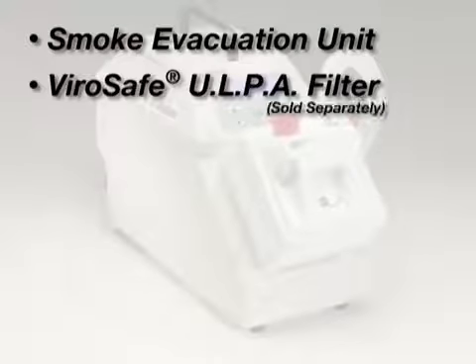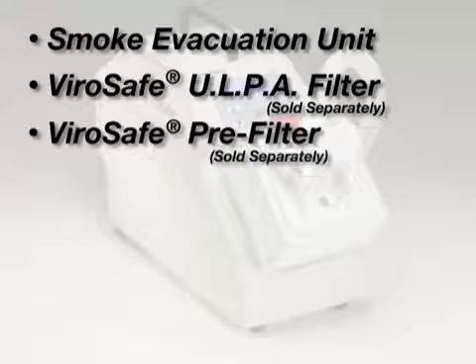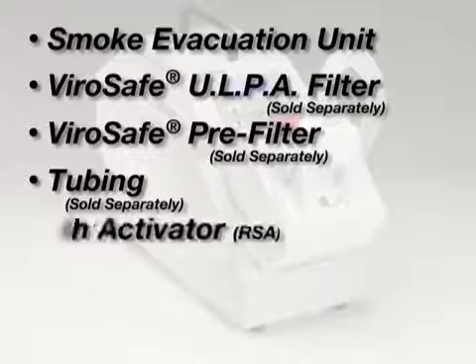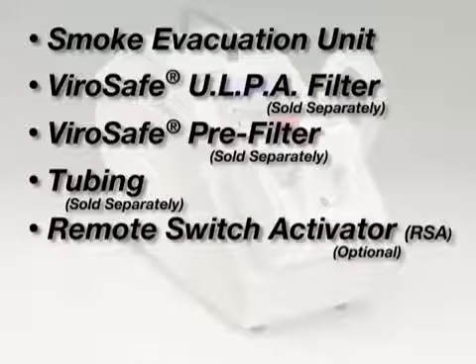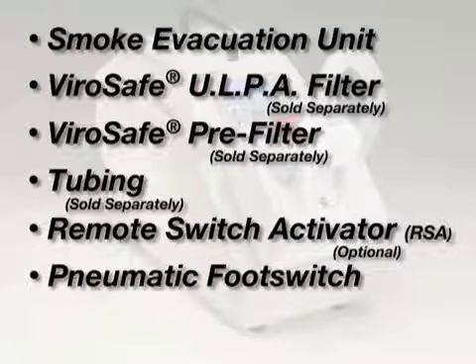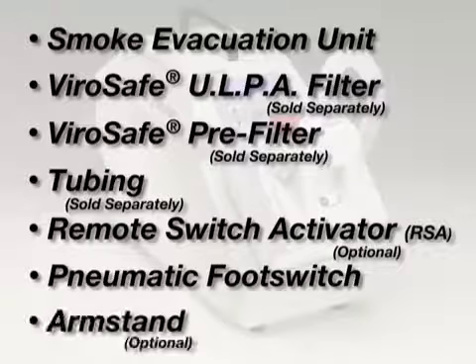ViroSafe ultra-low penetration air filter, ViroSafe pre-filter, if applicable to the procedure, tubing, the type of tubing selected will be based on the surgical application, optional remote switch activator, also known as an RSA, pneumatic foot switch, optional arm stand, if desired, typically used in non-sterile environments.